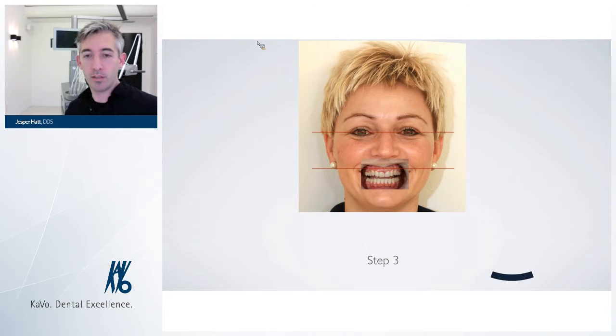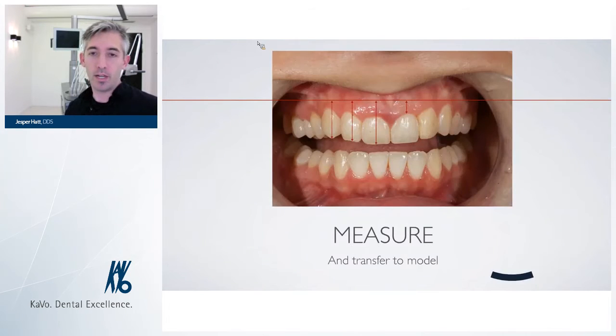This way we can just enlarge it like this, and we can start to make some measurements. I'm not going to go into details about how we measure this up. Christian Coachman does this a lot better with his digital smile design, and you can buy beautiful apps for your iPhone and for your computers on the internet. So these tools are really useful and helpful, and they are easy to apply in the practice. I don't have anything to do with these products. I'm just mentioning them because I really like to use them. It makes my life a little bit easier.